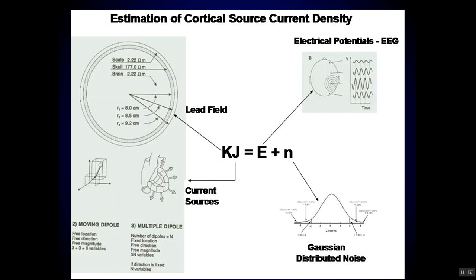The distributed method is seen here. It was used in cardiology at the turn of the century, the early 1900s, in which now you have inside the brain a whole large volume of current densities. A lot of these little X, Y, and Z current representations are now inside each of the voxels.